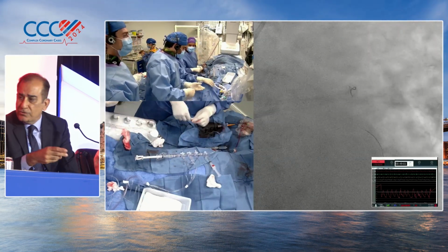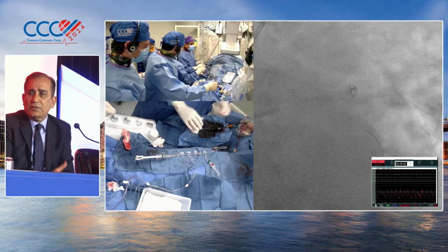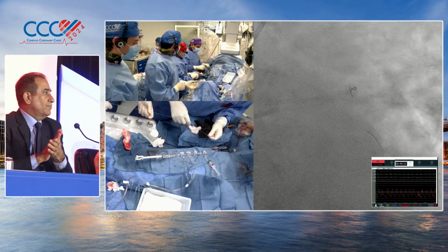So now what balloon do we have? Okay, so basically, if everybody's okay, we are done here. Yeah, that was a terrific case. Thank you so much. Terrific case. Congratulations. And let's go across the hall.